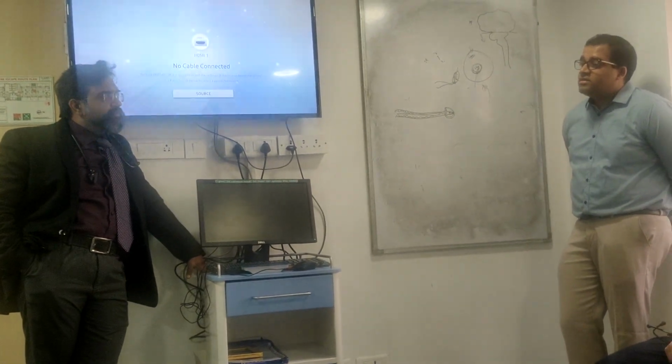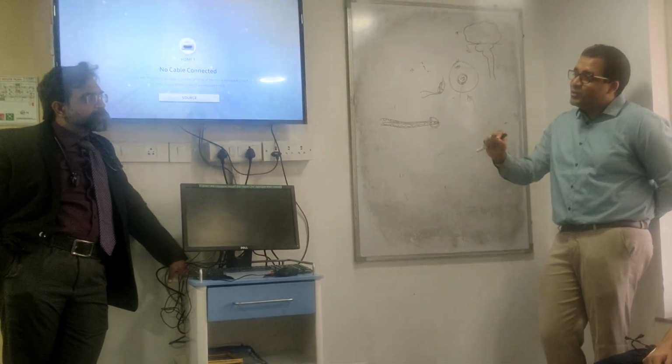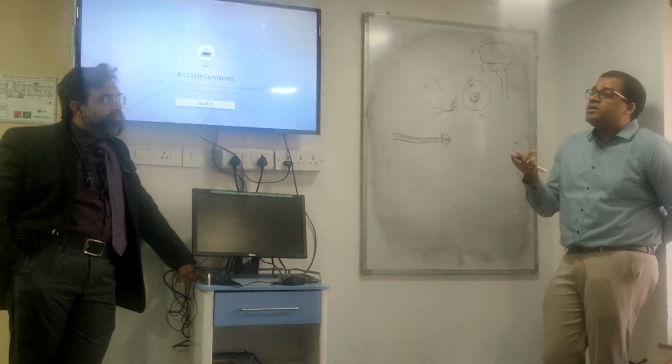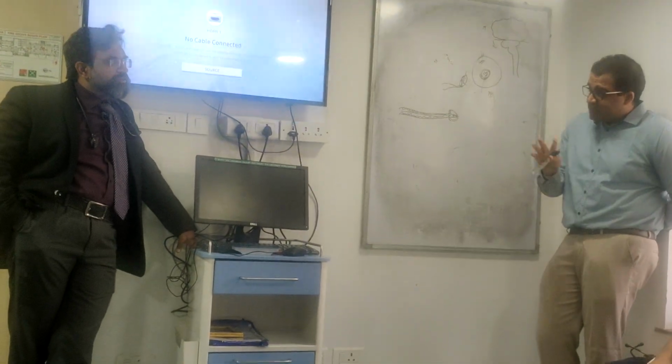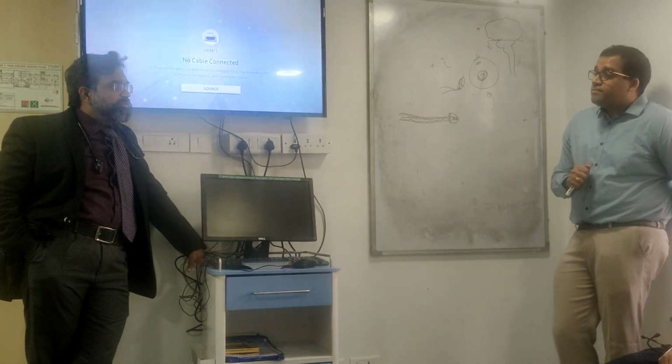In dialysis catheters, we do. We have central line red hub and central line blue hub. Separately they usually send 2 from the double lumen catheter, 3 from the triple lumen, plus peripheral, right? Depending on how the catheter is. And a step up of the organisms might indicate it.